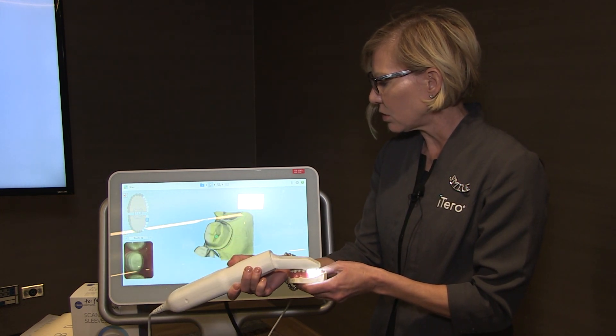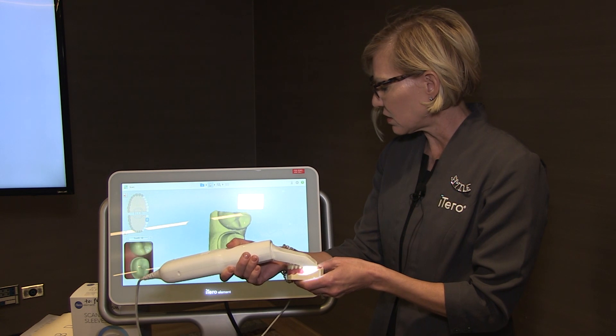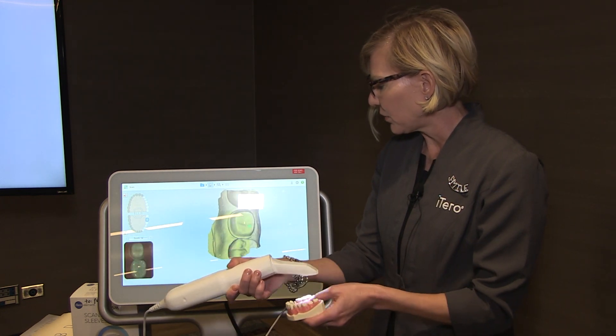Occlusal, lingual, buccal, distal, and then mesial. And stop.